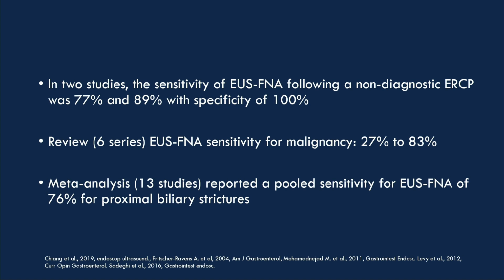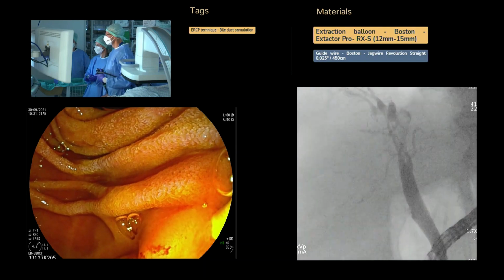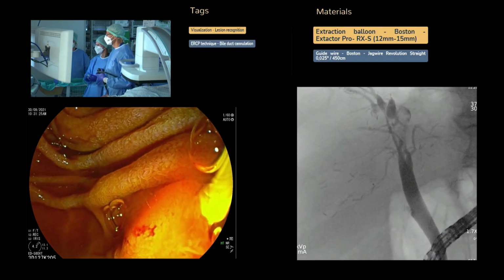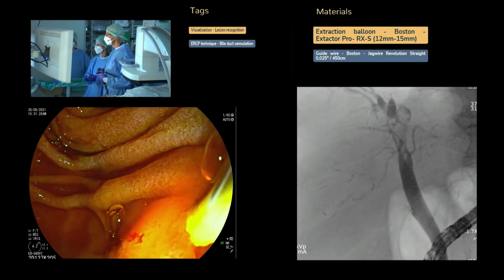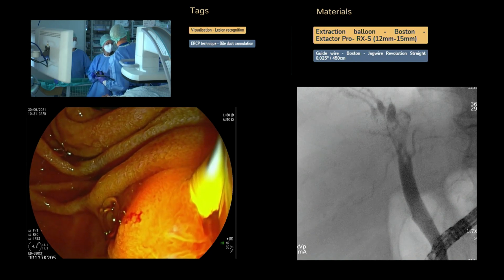But first we will interrupt this presentation because we see that the narcosis room is ready and we want to show a live case of a proximal stricture. You see that? Yeah. We see the black spot just on the right bile duct. And I can go easily, because the question is, should we make a dilation before putting in the stent? What would you do, Peter?